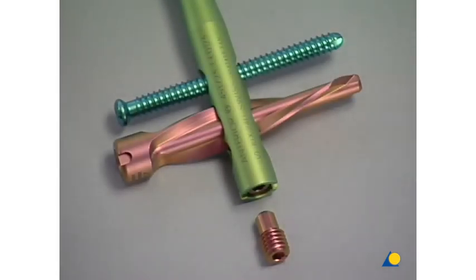In patients with fractures in osteoporotic bone and fractures with an extended supracondular comminution zone, spiro blade locking is recommended. A more stable retention is achieved through the larger contact surface of the spiro blade, which allows a better distribution of the axial load exerted on the condyles. For this method, a spiral blade, a 6 mm locking screw, and a pink end cap are used.